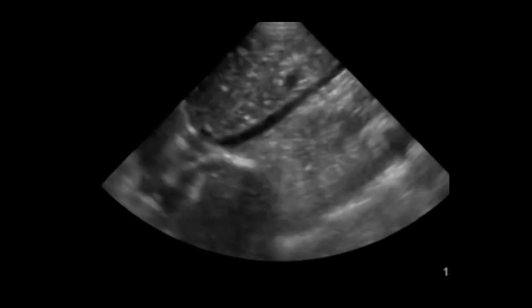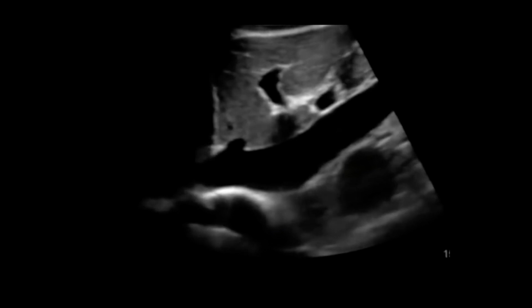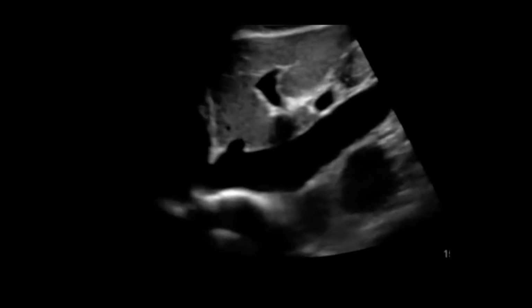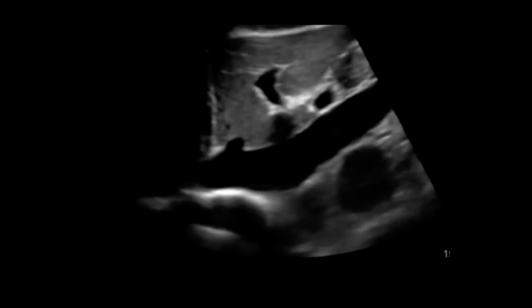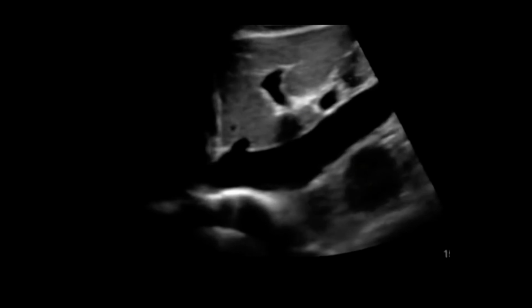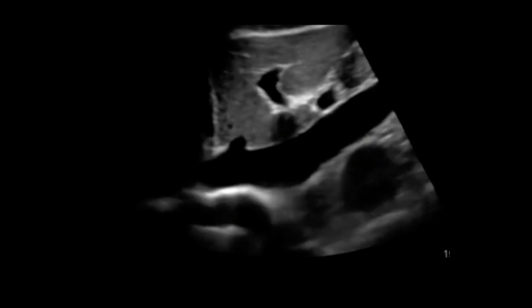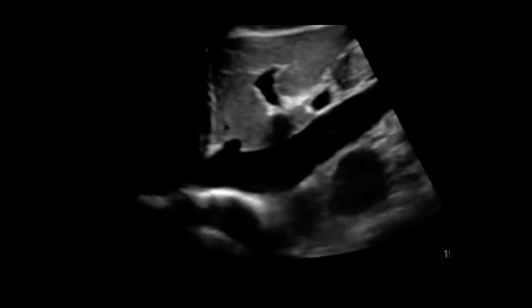Vice versa, if we see a plump IVC greater than 2 to 3 centimeters with no or very minimal inspiratory collapse, this can suggest an elevated CVP, and fluid boluses are unlikely to help your patient. We should consider other methods to improve cardiac output and raise their MAP, such as inotropes.